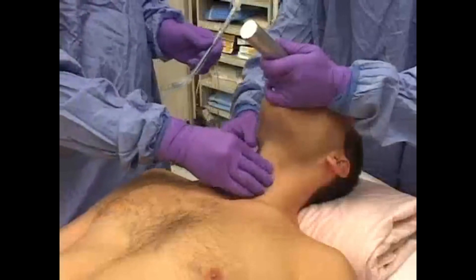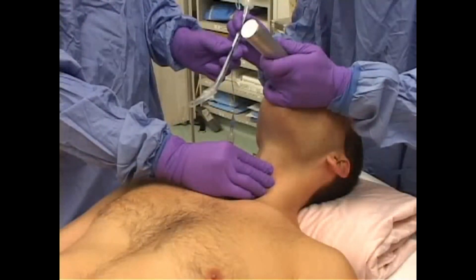After the view has been optimized by the laryngoscopist, an assistant can transiently maintain external manipulation at this location, freeing the laryngoscopist's right hand to place the tracheal tube.